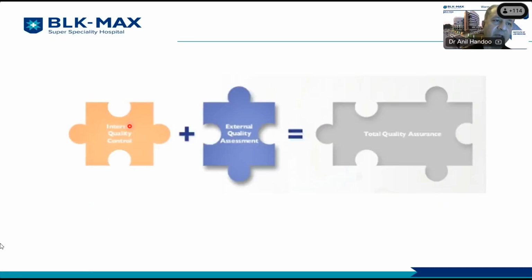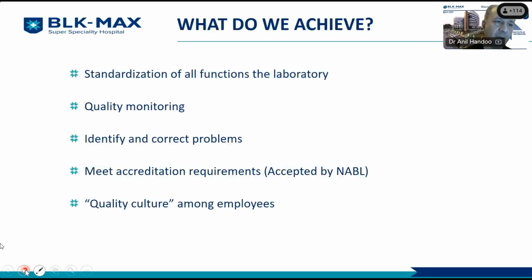So when you look at the IQC and the EQA together, you get what is called total quality assurance. Now, when you have heard me in all these slides so far, what did we achieve? We were able to show you that you can standardize all functions of the laboratory together. I think I was able to show you that there is something called quality monitoring, which we were able to do in all these cases.